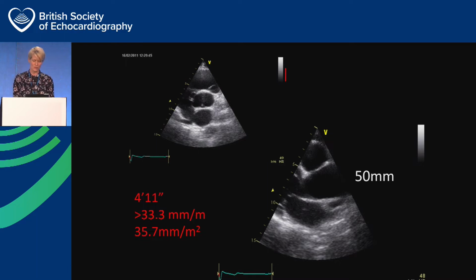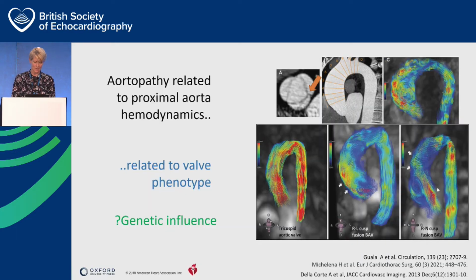And actually what matters is really, is it normal or not? Do they need surgery or not? And everything in between doesn't really matter so much. It really just matters how it compares to the last scan.